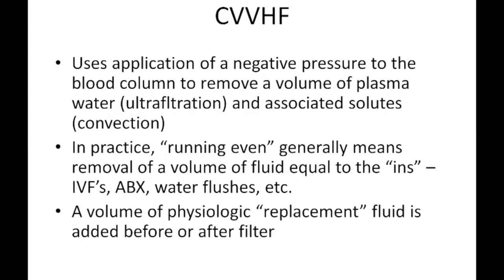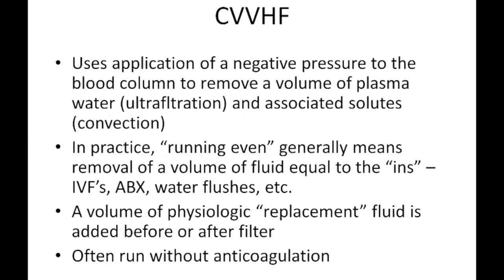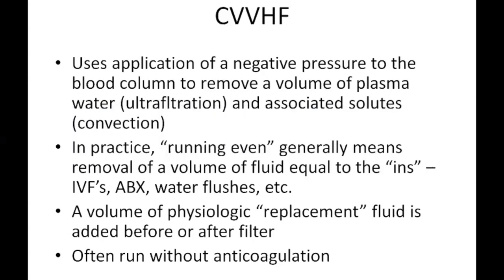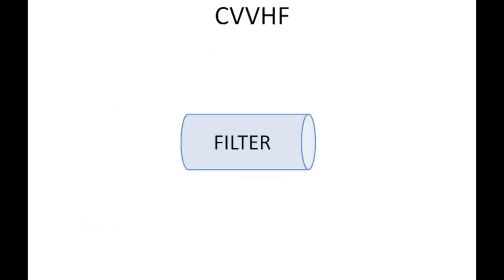Now, as we said, a volume of replacement fluid, which is basically very similar to IV fluids, is added either before or after the filter, and that replaces the water that's removed from ultrafiltration with this clean solution. For us, this is typically run without anticoagulation, but in our situation for COVID patients, we generally will run with anticoagulation with heparin, and we'll talk about that when we get to some practical points about COVID patients.